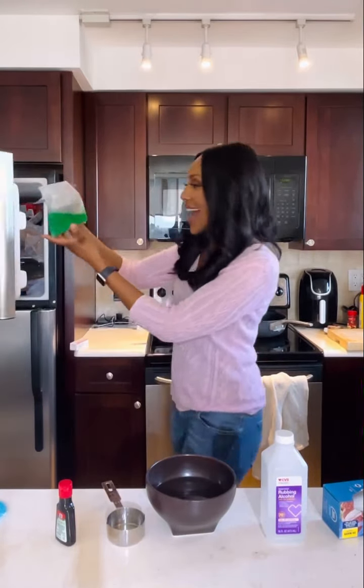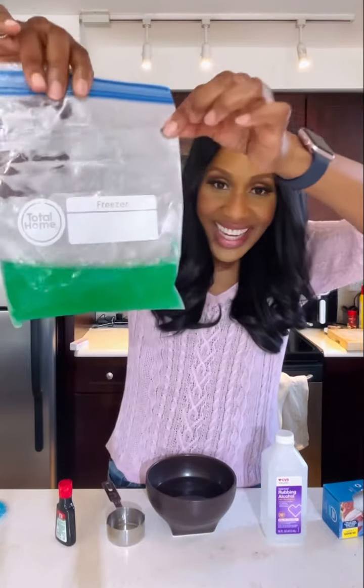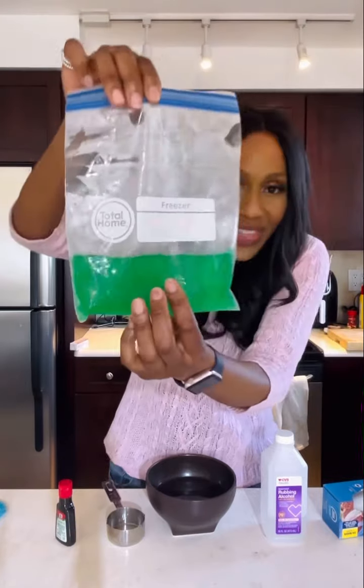Okay, what do we do now? Well, we stick this bad boy in the freezer. We're gonna leave it in for a few hours, okay? Okay, now let's see what we got, okay? Let's take a look at the freezer, pull out our gel ice pack, and see what it looks like, all right? Here it is, guys. Take a look at it. It is a gel substance. Would you look at that?